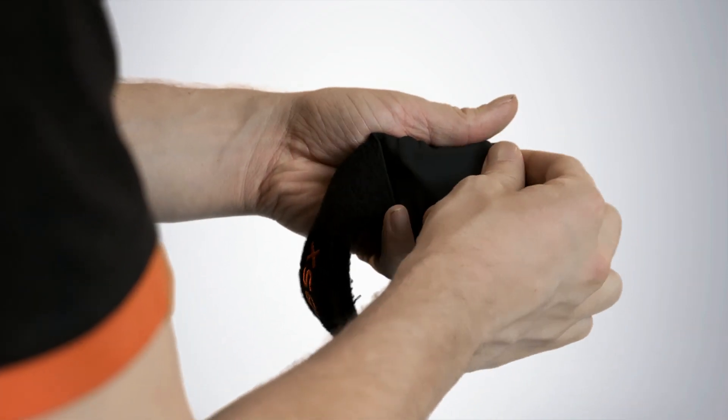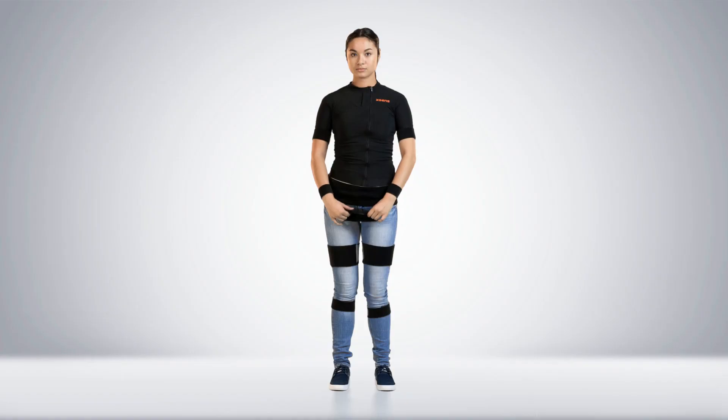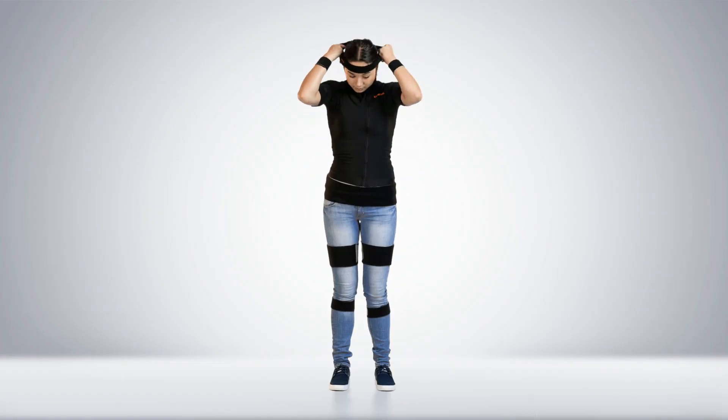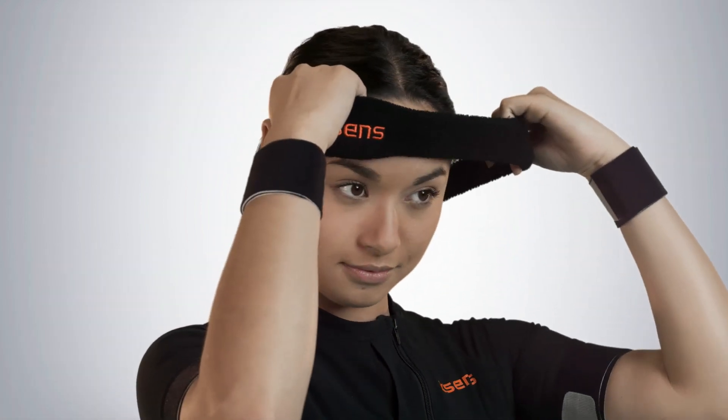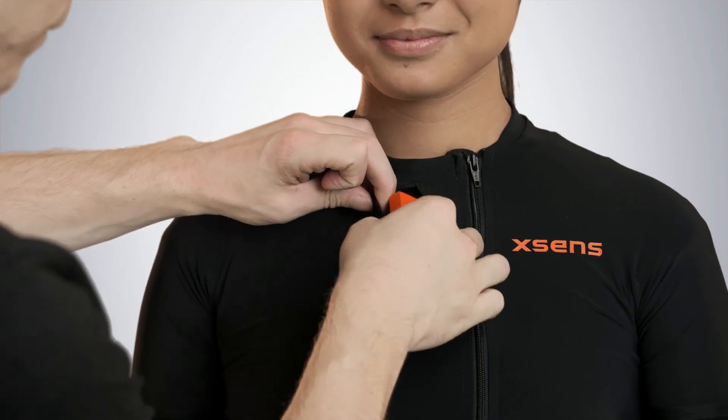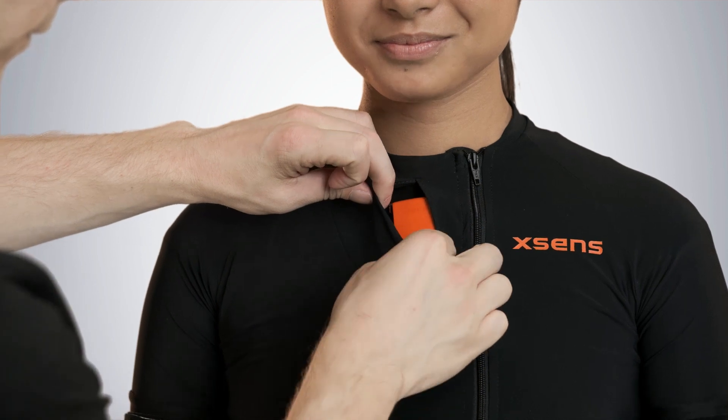Insert the motion tracker into the headband and place it on the head. Place the sternum motion tracker and make sure you cover it with the fabric.